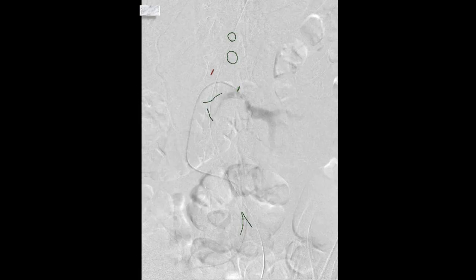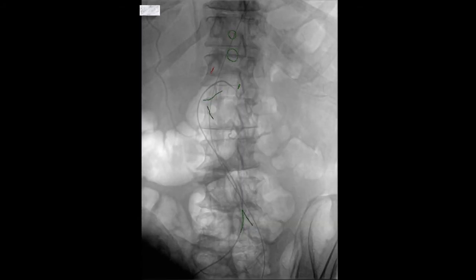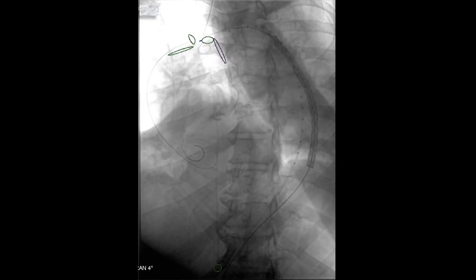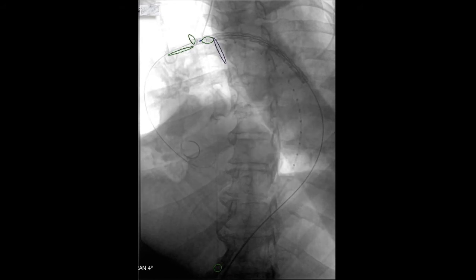We cannulated the left renal artery fairly well. You can see that beyond the area of compression the true lumen, which is intact, crosses the false lumen into the left renal artery, so it has not been avulsed. The kidney actually perfuses fairly well beyond that, so the plan was to salvage it rather than sacrifice it. Using IVUS, we confirmed true lumen placement of the curved Lunderquist wire. We use IVUS in all of these patients. Once the true lumen is established, we never remove that wire to ensure the stent graft wire is never displaced into the false lumen.